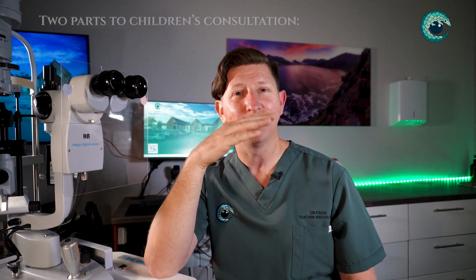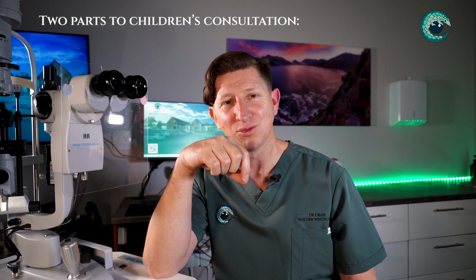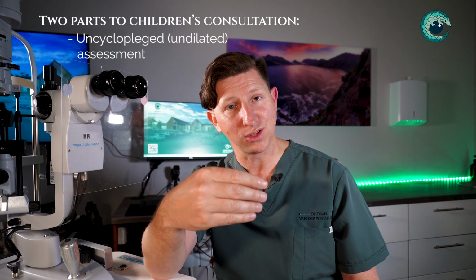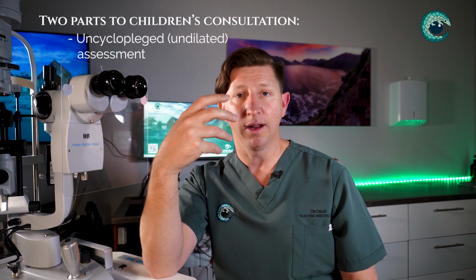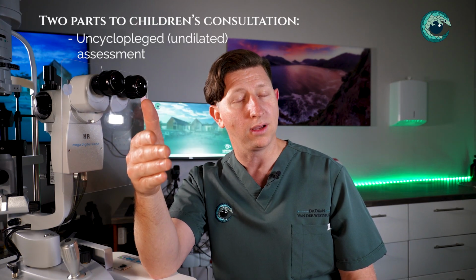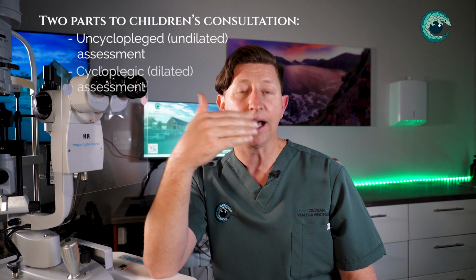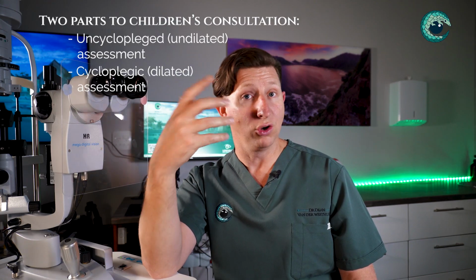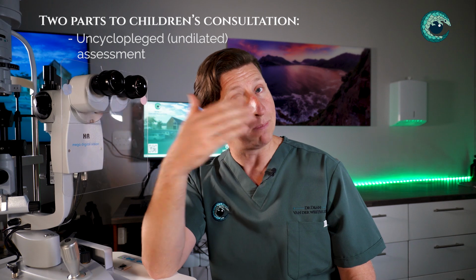And so normally there are two parts to most consultations with children. The first part is assessing them undilated, or uncyclopleged. We can check the vision, we can examine the eye, and then at either the same day or at another visit, we apply the cycloplegic drops and dilate the pupil. That allows us firstly to look at the retina, the posterior or back surface of the eye, and then to do a cycloplegic refraction, a glasses test.